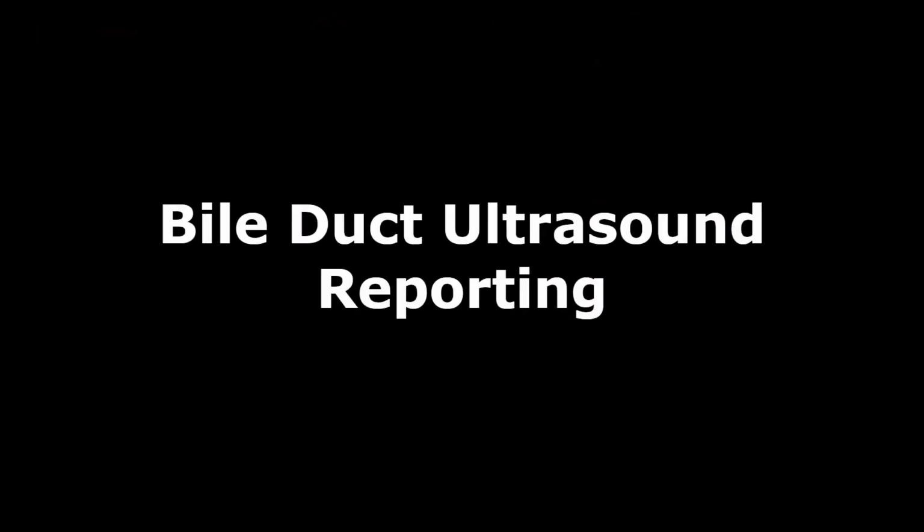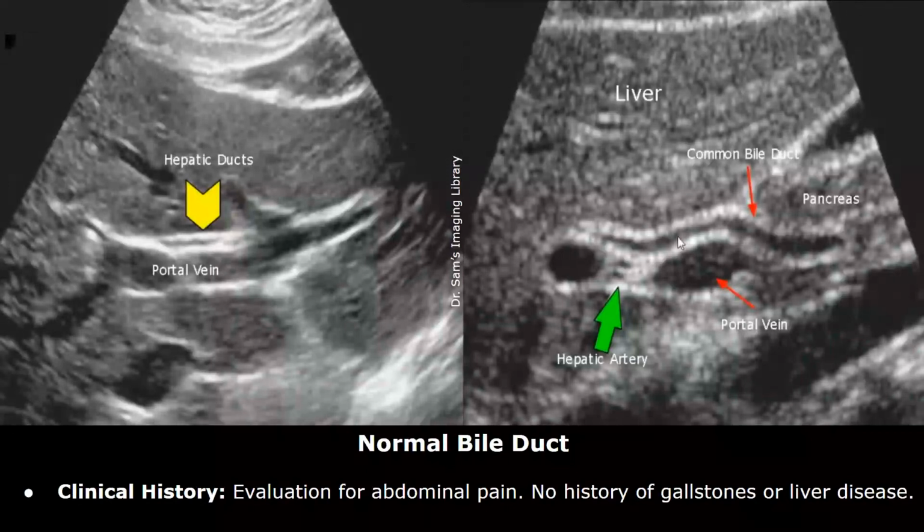And this video is about bile duct ultrasound reporting. You will learn how to write ultrasound reports related to bile duct pathologies. The main focus of the reports will be on bile ducts. The reports will include three parts: clinical history, findings, and impression. Our first report is of normal bile duct. This is the clinical history: evaluation for abdominal pain, no history of gallstones or liver disease.